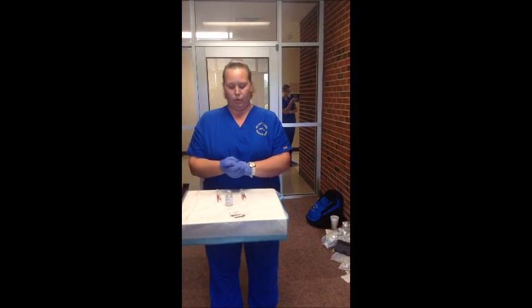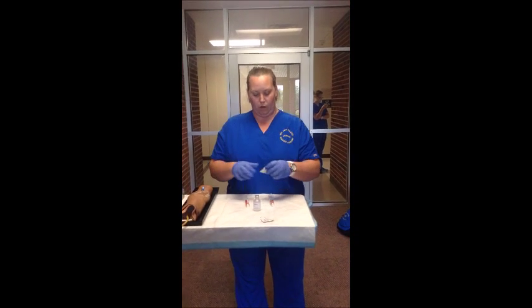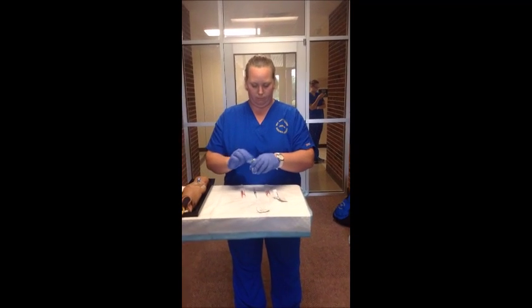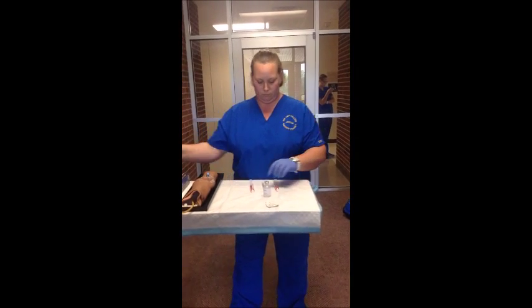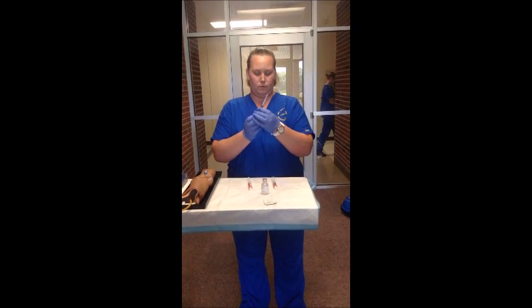Okay, so I would have done my dosage calculation and it comes to 0.5 milliliters, and I'm going to go ahead and get that. I'm going to mop the top. Trash can's over there. And get my syringe ready.